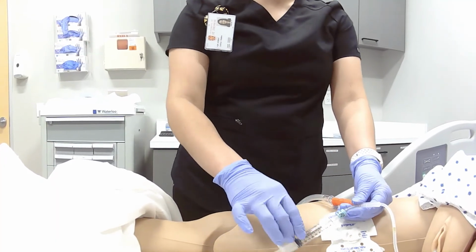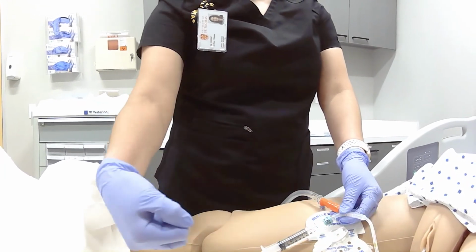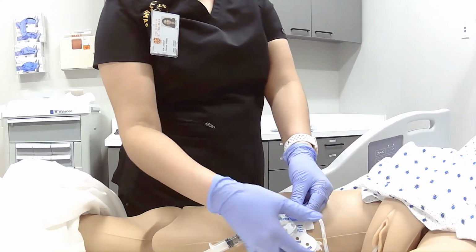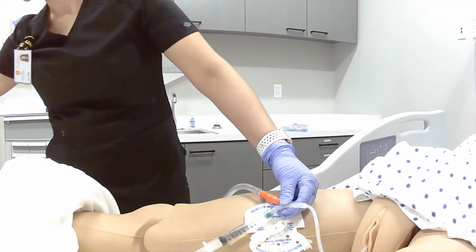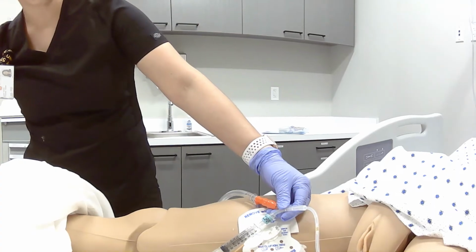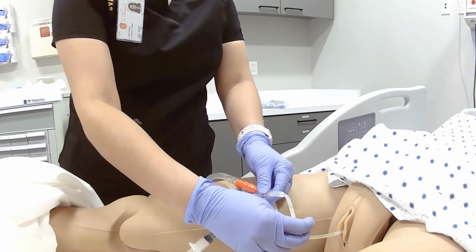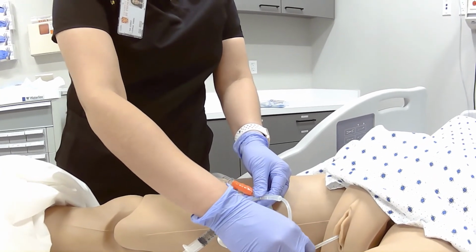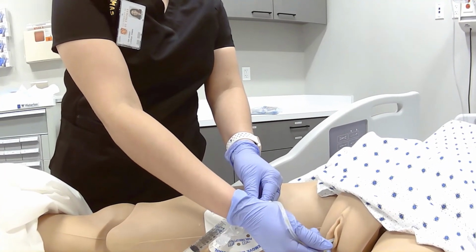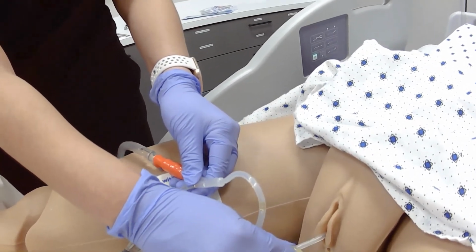So once that is out, I'm going to pull on that catheter gently. Don't just yank it out. You want to do it carefully, because you're going to have some urine spillage. You can also get some clean, dry wipes or a paper towel to help control any spills. I'm pulling it out gently, and one helpful way is to twirl it or curl it around my finger, so I have better control as it's coming out.